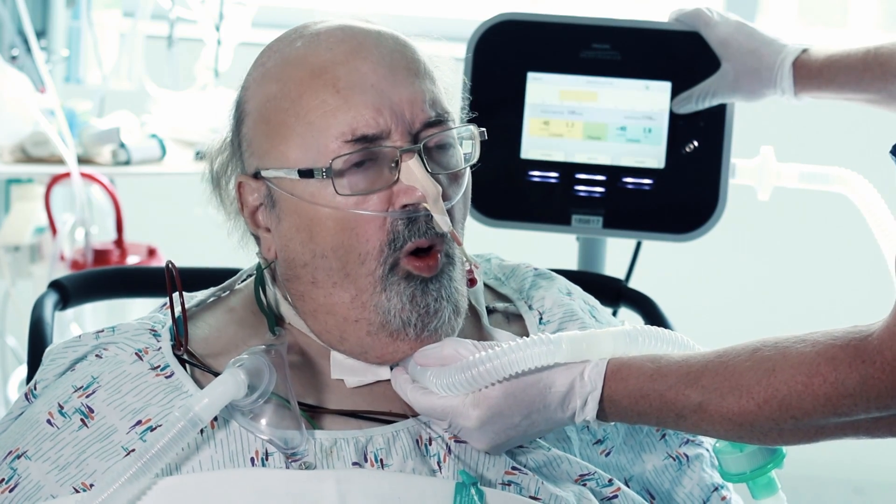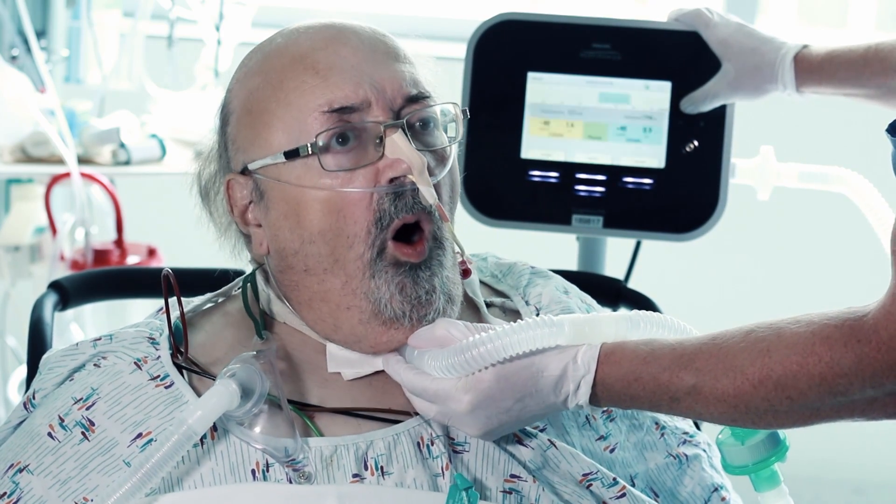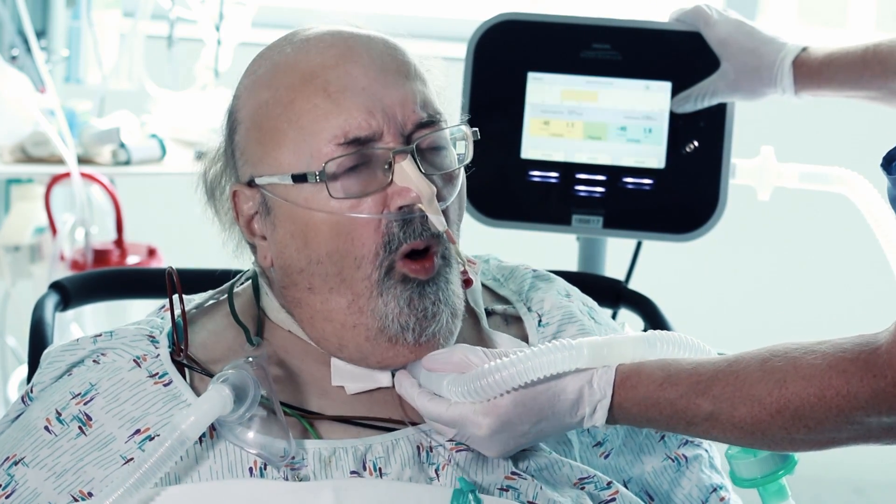Breath in, in, in, in, in, cough, out, out, out. Breath in, in, in, in, and cough, out, out.